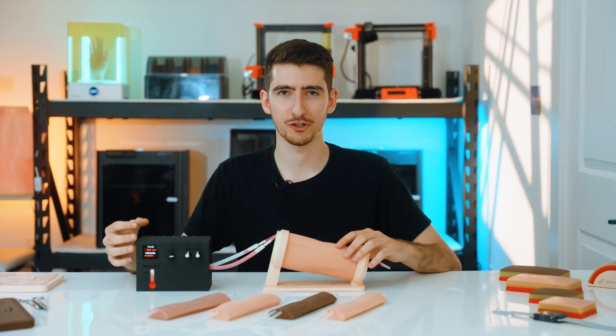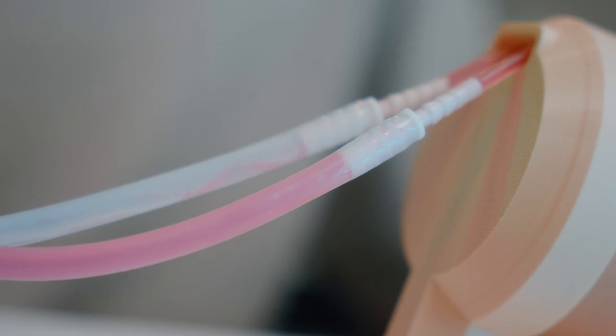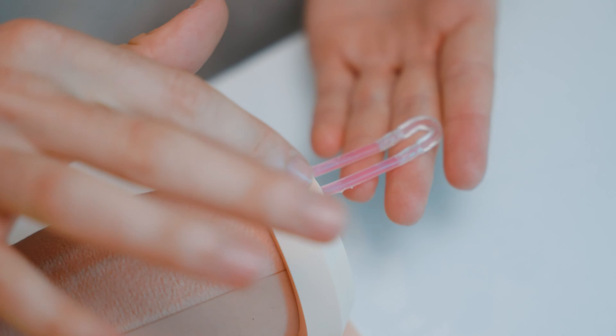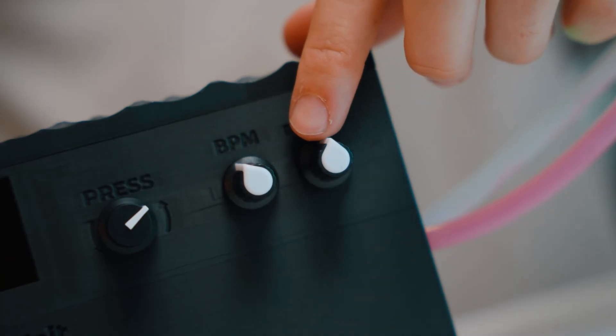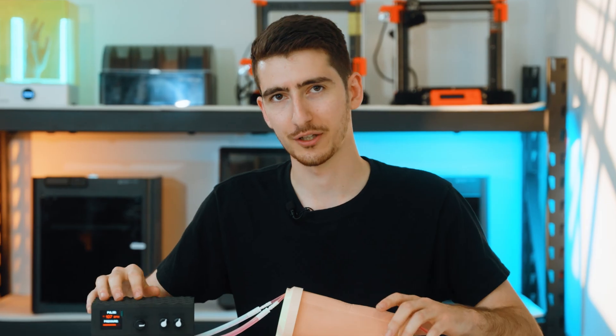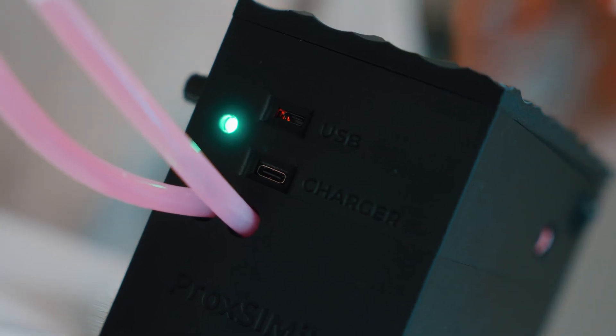Another part of the venipuncture kit is the Proximity blood circulation unit. This unit allows you to pass the blood through the veins and simulate how a real patient's blood would go through. With these knobs you can adjust blood pressure as well as heartbeat. The circulation unit also comes with a rechargeable battery that will last you a whole day of training.